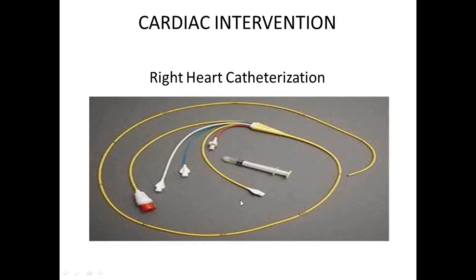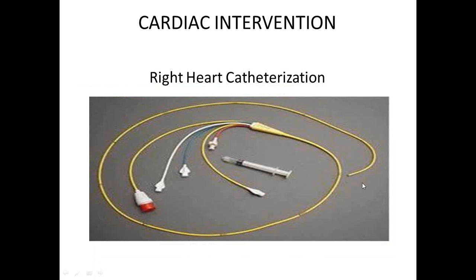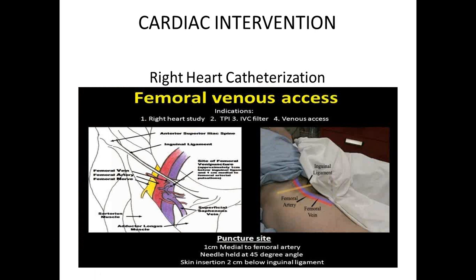Okay. And this is the actual catheter itself. The actual catheter looks like this. The balloon is right there, the distal tip, and then the different hubs. This is the syringe that we use to put about 1.5 mLs of air in the balloon port to blow the balloon up and wedge the balloon in place. So it's the Swan-Ganz catheter.